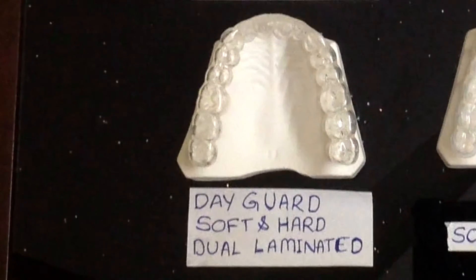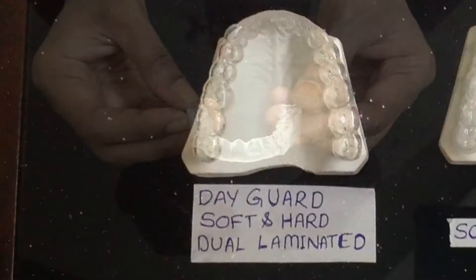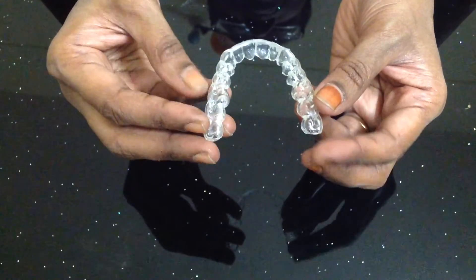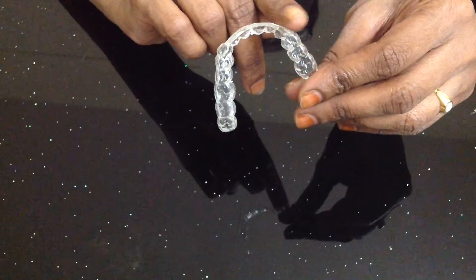Our fourth option is the dayguard, which can be worn during the daytime in the office. It is a dual laminated flexible guard. This version covers only the occlusal surfaces of the posteriors — the incisors are not covered labially. This is suitable for day bruxism.